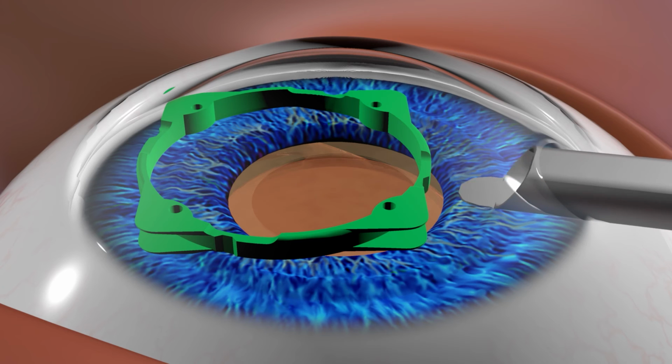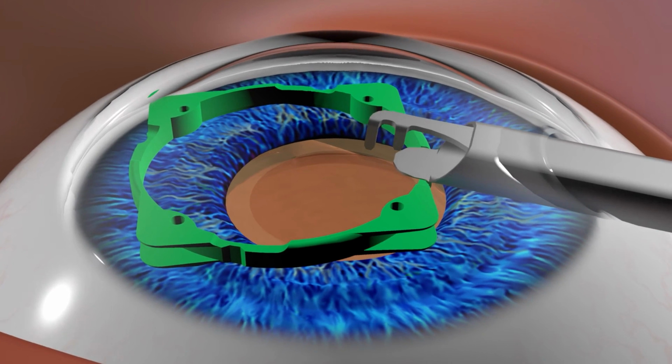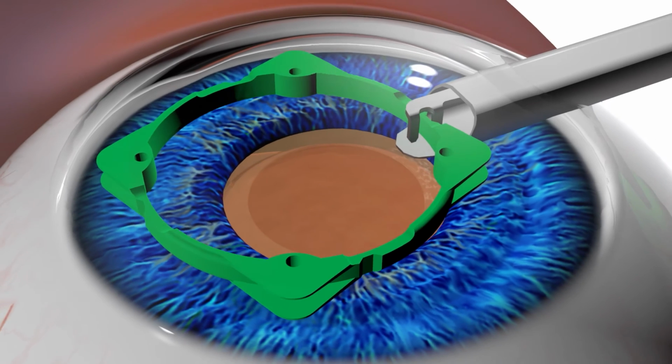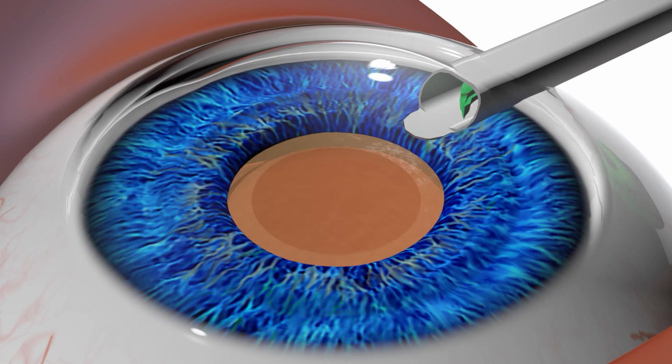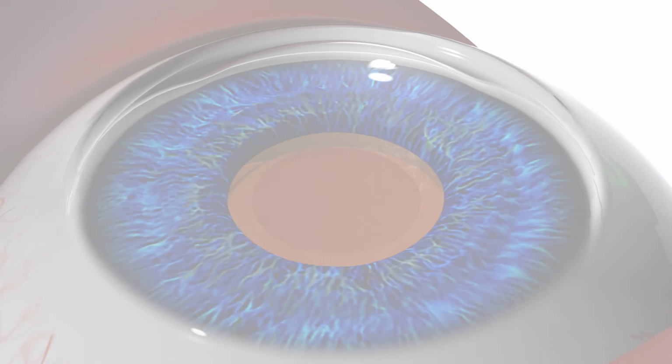Reintroduce the inserter and gradually extend the prongs forward. Carefully position the cannula platform under the hinge and retract the prongs to draw the ring into the cannula.